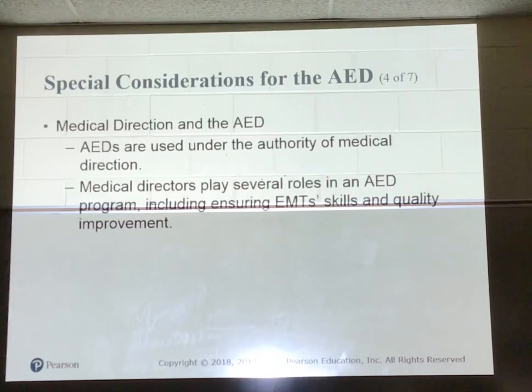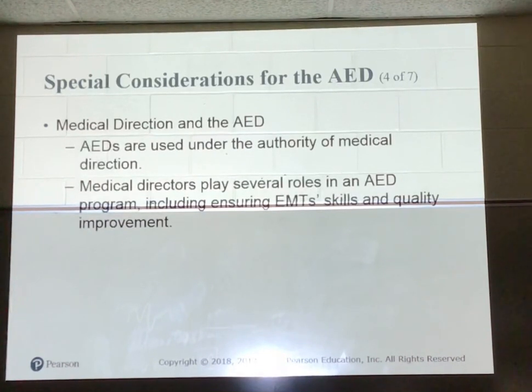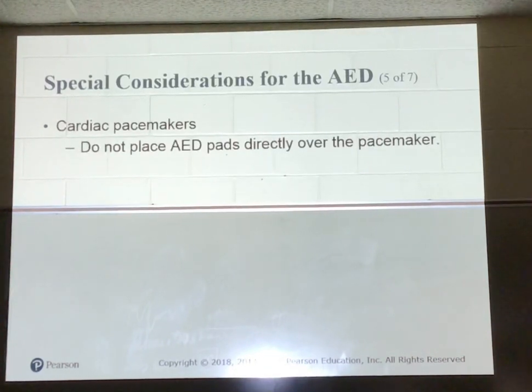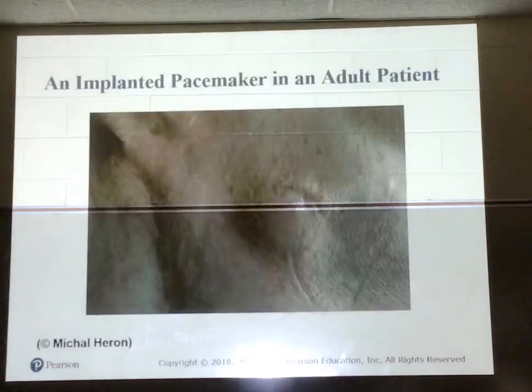All right, medical direction. AEDs are used under the authority of a medical director. Medical directors play several roles in AED programs, including ensuring that you have the skills and quality to use it. Do not place the AED pads directly over a pacemaker. This is what a pacemaker looks like.